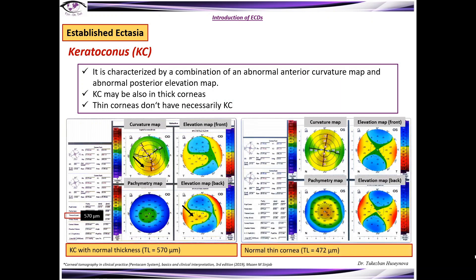In this case, you can see that there is no pathology in curvature, posterior or anterior elevation map, or pachymetry map. However, the thinnest location is 472 microns. So thin corneas do not necessarily have keratoconus.